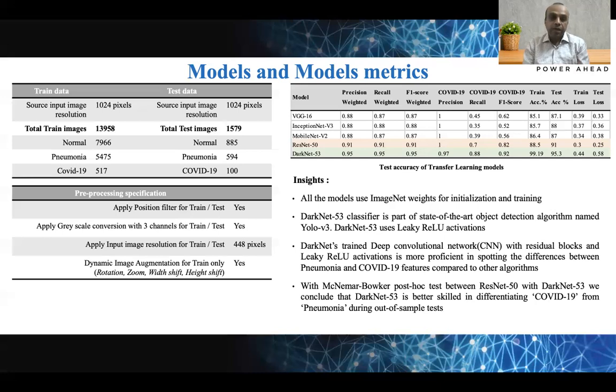What we observed by doing this augmentation technique for all the models is that we are able to generalize the model well, and the model is able to identify the correct pathology even when the X-ray images are slightly changed, which is expected in the case of test images.